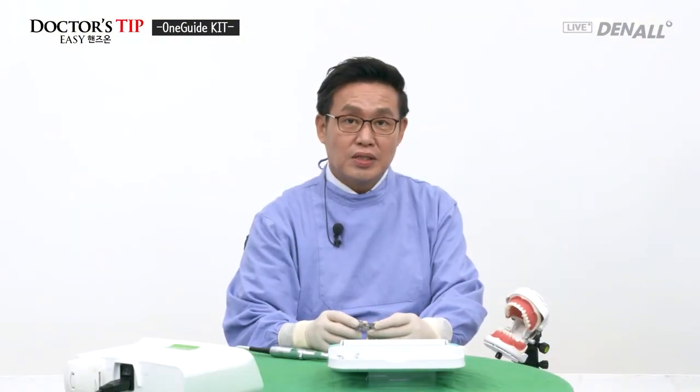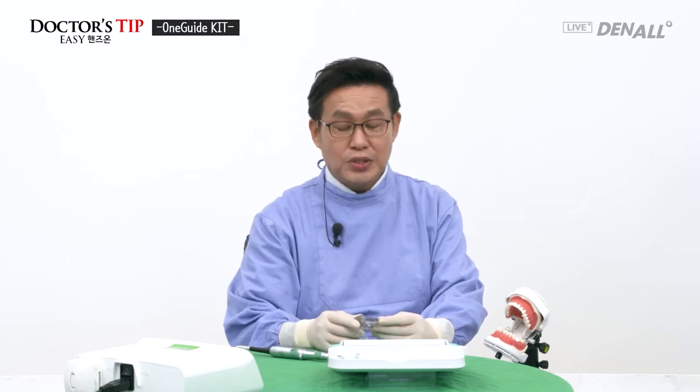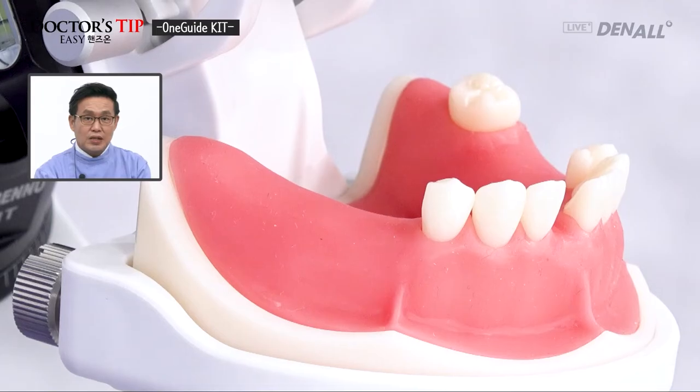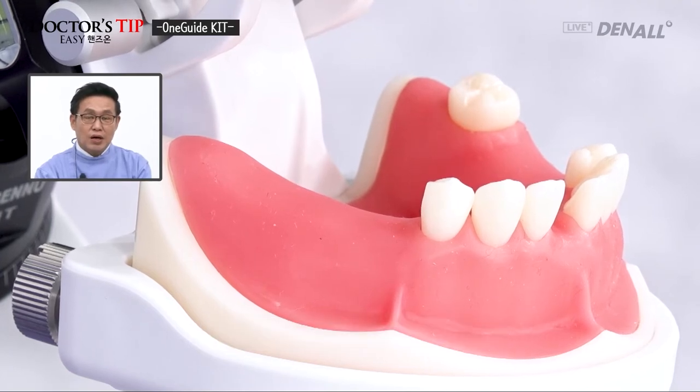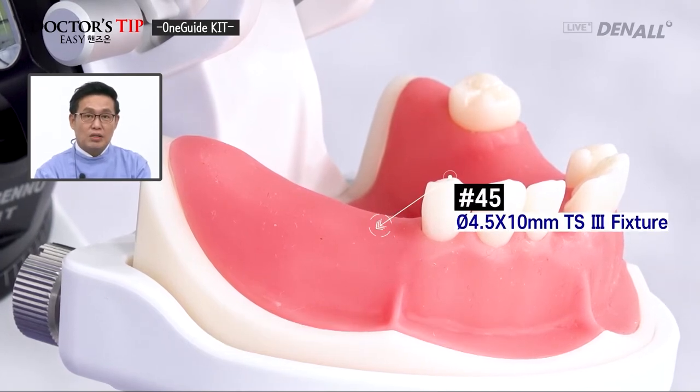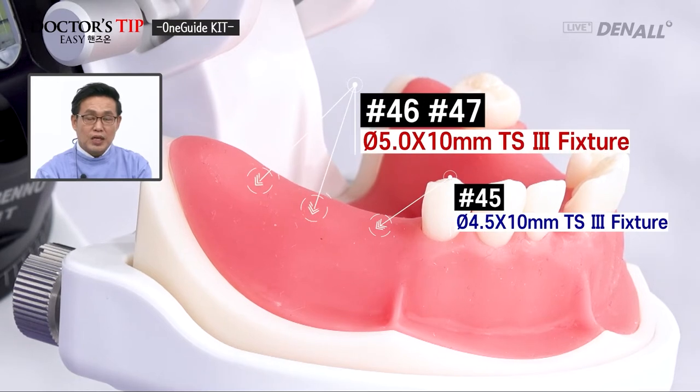I'll begin the hands-on practice. First of all, the case is 45, 46, 47. Three teeth are missing. For 45, a 4.5 by 10 millimeter TS3 fixture is going to be placed. And for 46 and 47, 5.0 by 10 millimeter TS3 fixtures are going to be used. I will now show you how it's done.